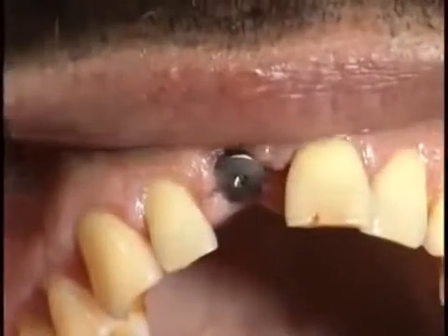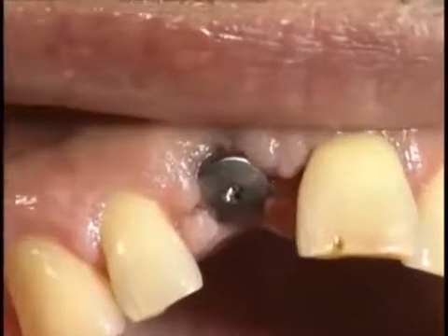The missing single tooth 1-1 is to be restored with a transversally screw-retained porcelain crown. There's sufficient interocclusal space, and soft tissue management and the gingival emergence profile are favourable following uncomplicated osseointegration of the Straumann implant.